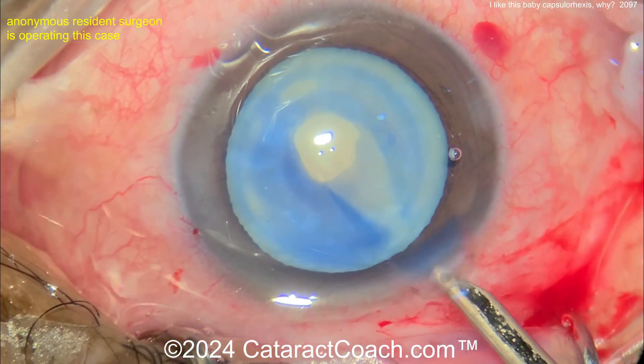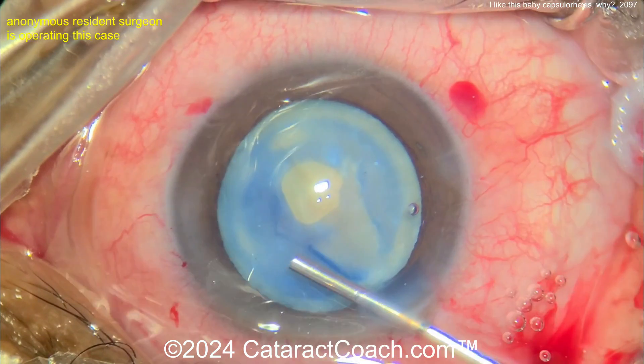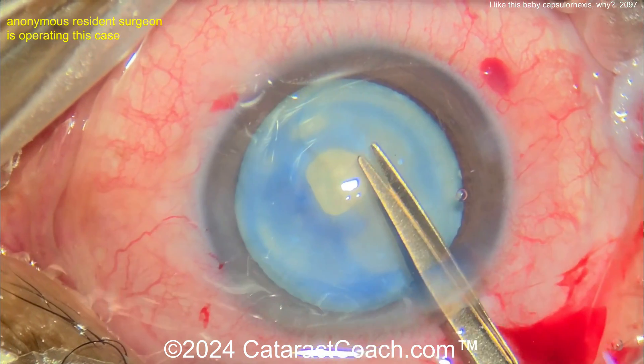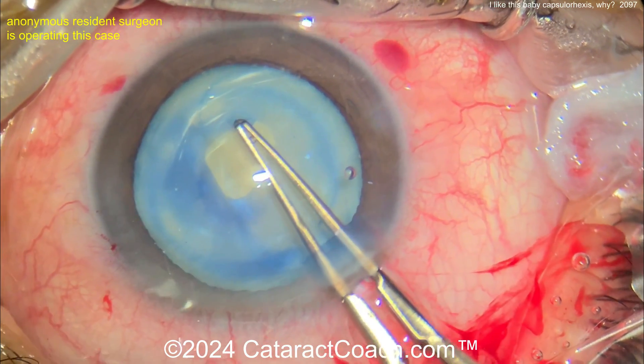Now you can decompress the bag. Going in with a Simcoe cannula — a little irrigation and aspiration — to just move that lens nucleus around and decompress the capsule bag much better. You get out that liquefied lens material, that lens cortex, and then now you can nick the capsule with some scissors and create a large, normal-size capsulorrhexis.